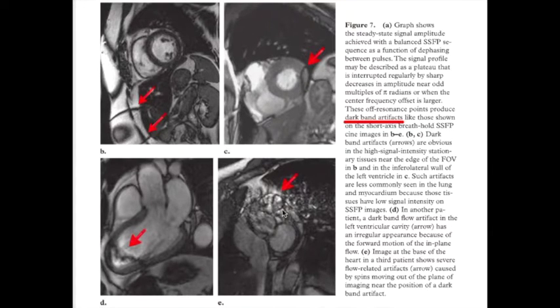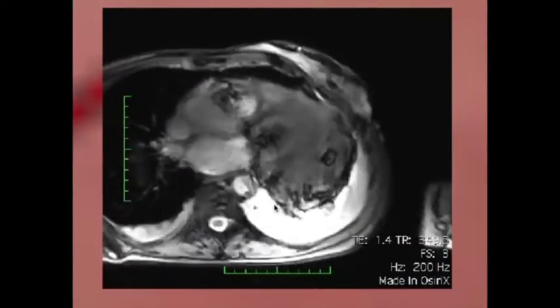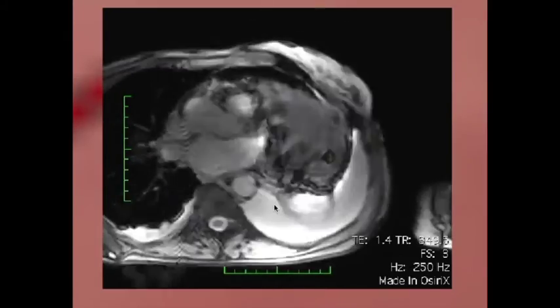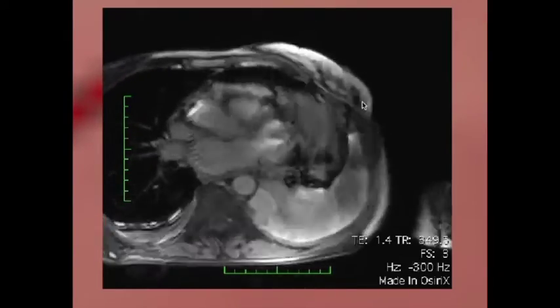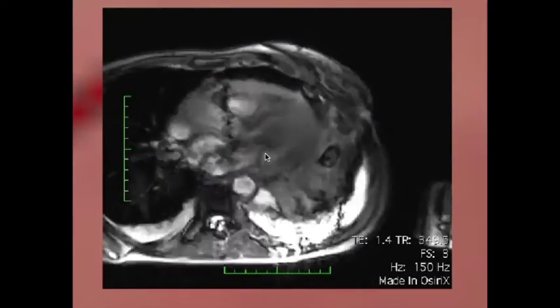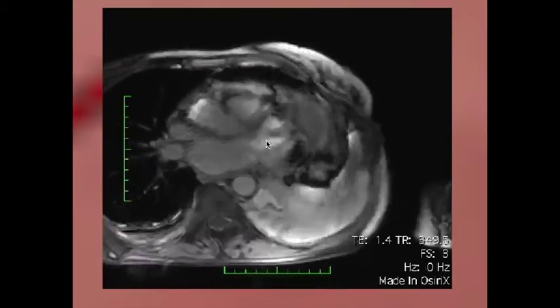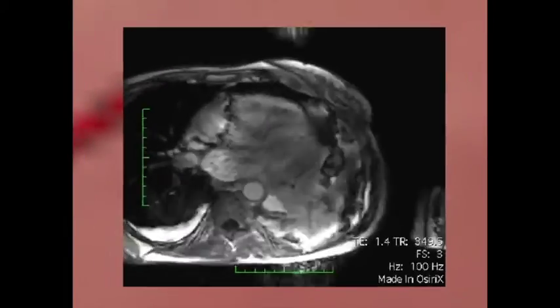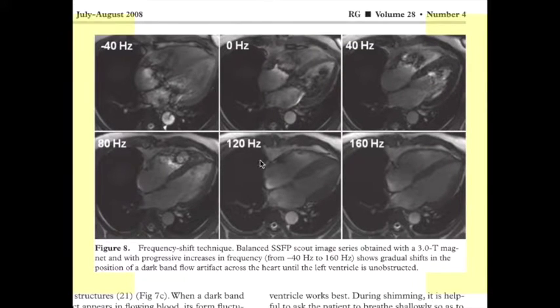One trick we can apply is called frequency scouts — acquiring the same image at different frequencies from minus 300 to plus 300 Hz. We look for the one with the least artifact throughout the myocardium or for the area of interest. For example, if specifically looking for mitral valve regurgitation, pick the frequency that looks cleanest at the level of the mitral valve. The tech can just punch that number in and change it.